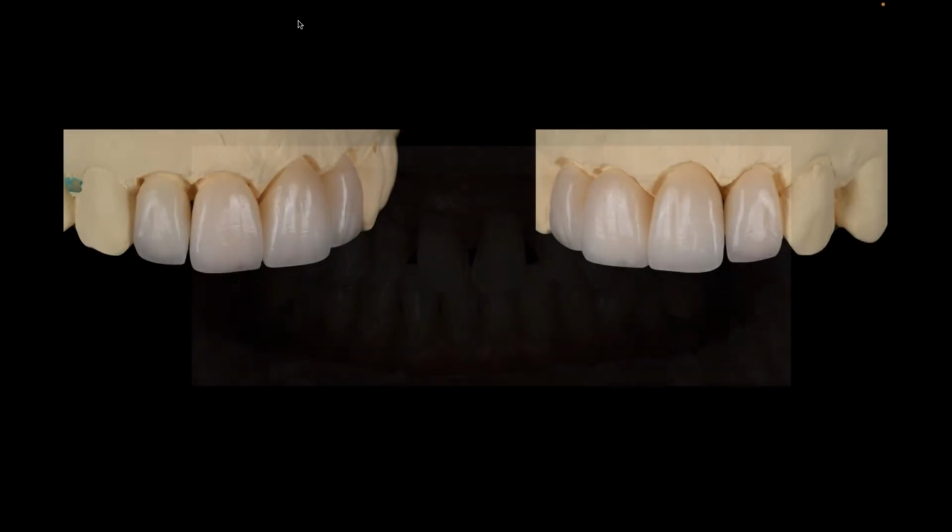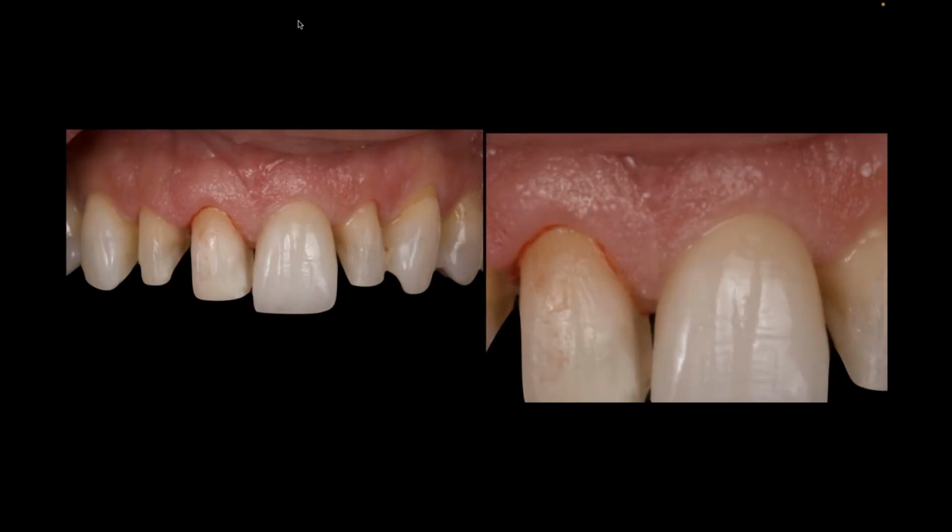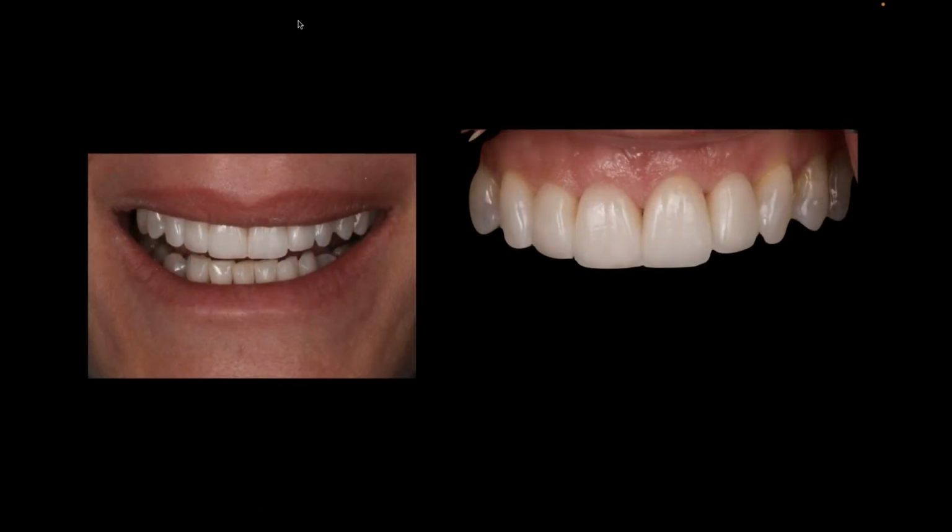And you see when we go to place that in the patient's mouth, I like this shot because you can see how nice it kind of goes around the tissue and really kind of absorbs in there. And notice, look at her cuspid and look at my central. I have a fairly similar amount of translucency, not a ton. I have a similar kind of value, maybe a hair brighter in the central. And we'll just place all 4 veneers. This is still the patient numb, so the tissue hasn't healed in yet, and you kind of get the idea. But that's my way that I kind of go through the shade taking process.